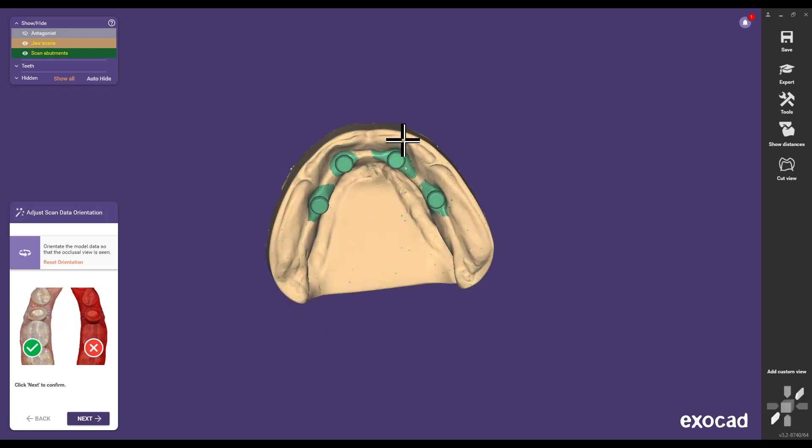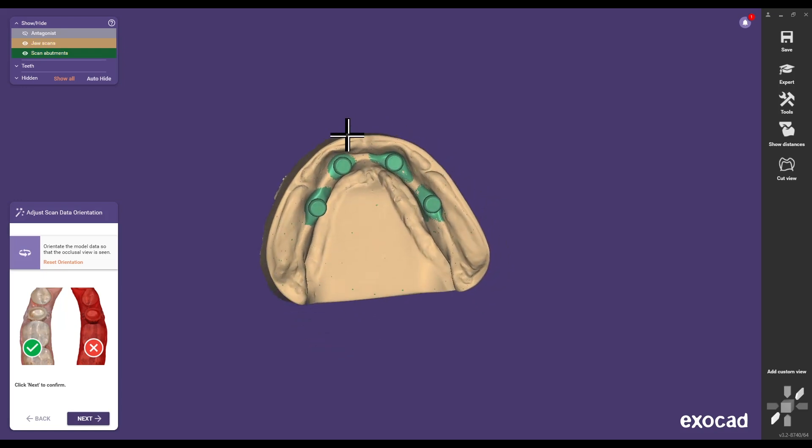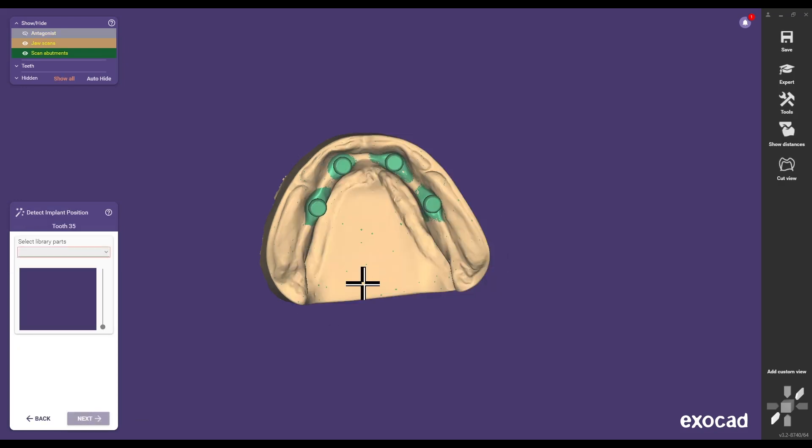After importing the scan files, select the integrated library and match the scan bodies tooth by tooth.